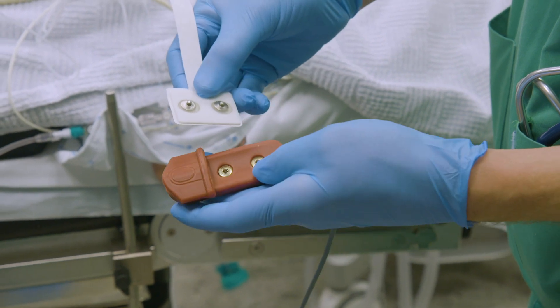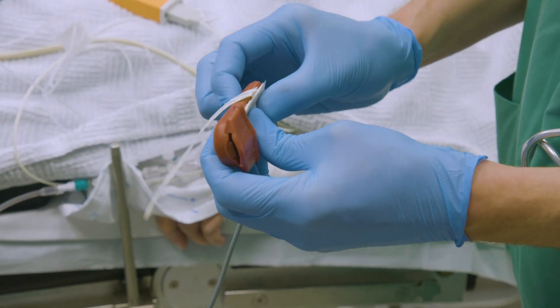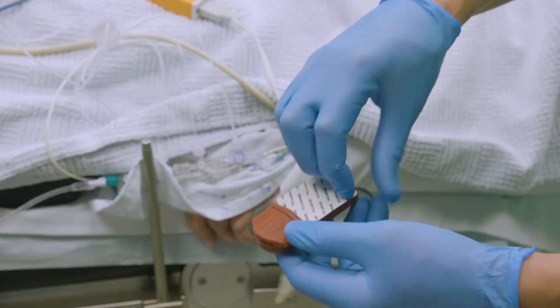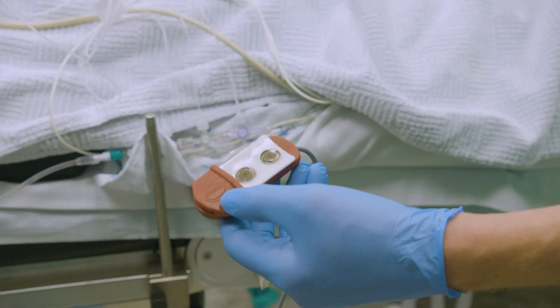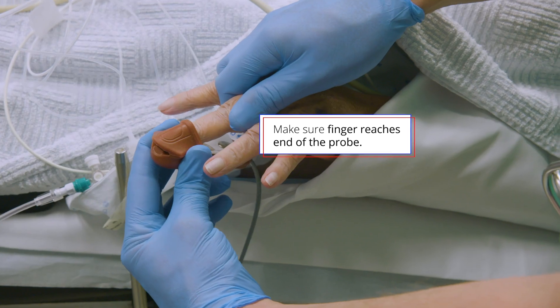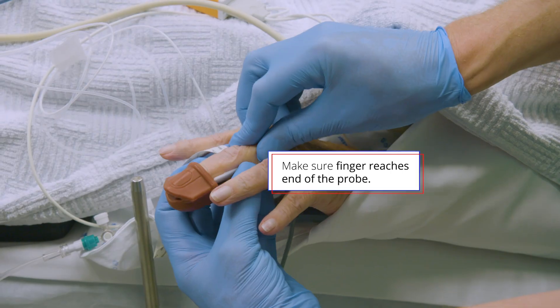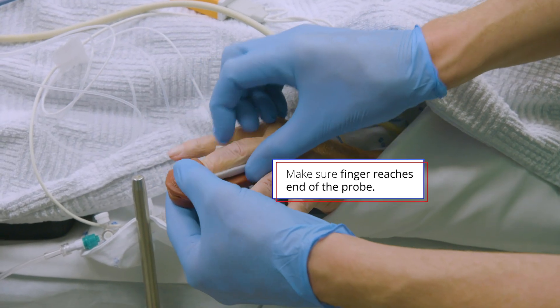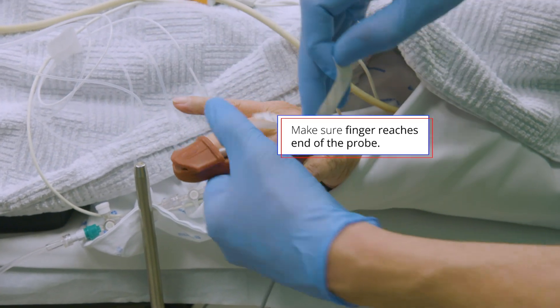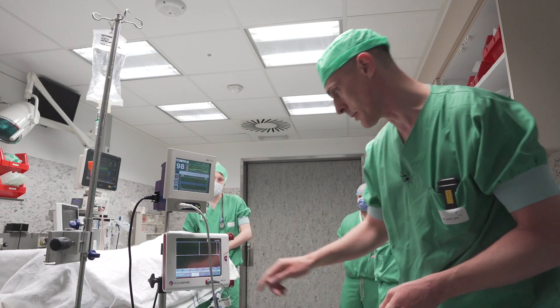You just put them on like this. You take off this part and this is a sticky zone. To put the fingers on the probe, you take an angle of 30 degrees and put the finger in the probe. Then you just put the sticky part against the finger and make it close up to the finger like this. Then you remove this part and you turn it around the finger of the patient — not too tight.